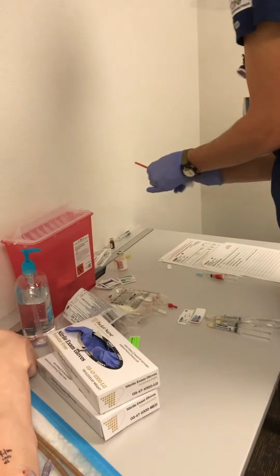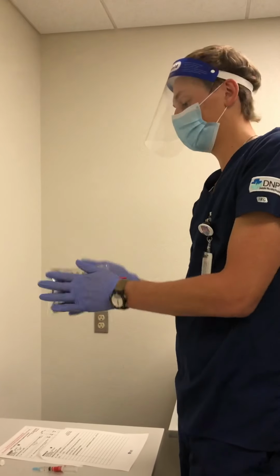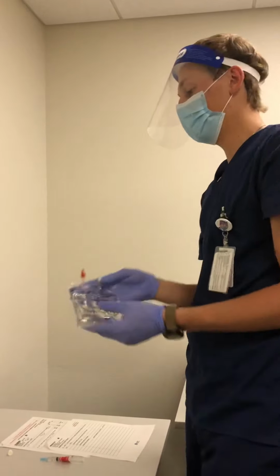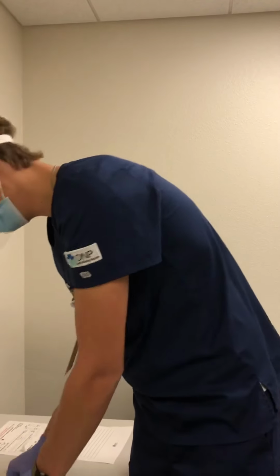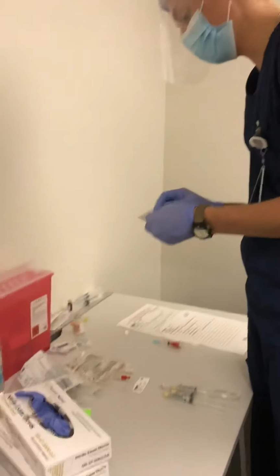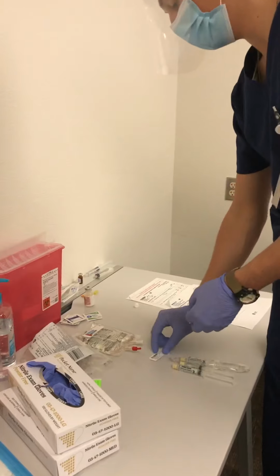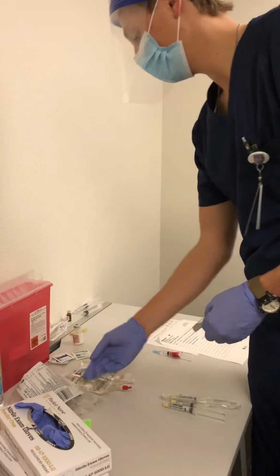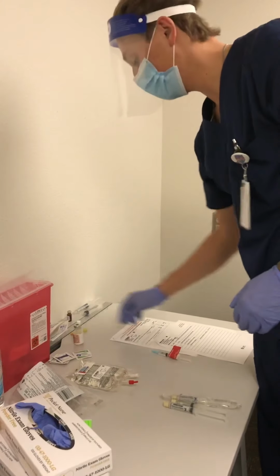I can dispose of this into the sharps, this into the garbage, and then I can hand mix this by just squeezing, rolling it over, rolling it back and forth. Okay, and then I can put on my medication labels here, and do one last medication check before leaving for the patient's room.